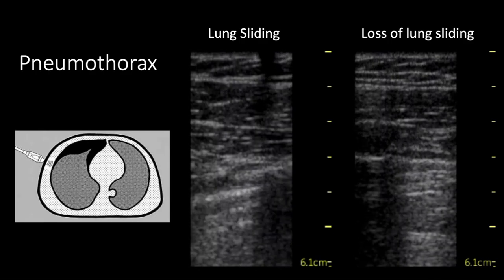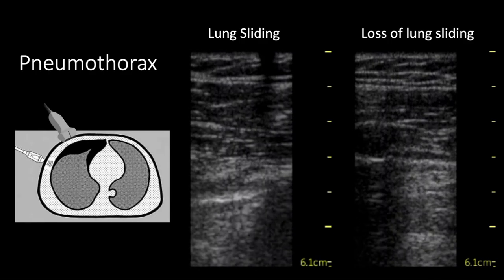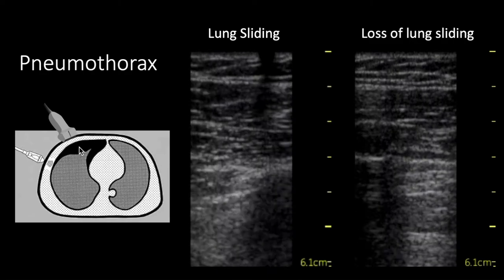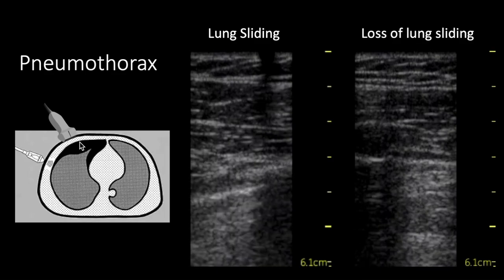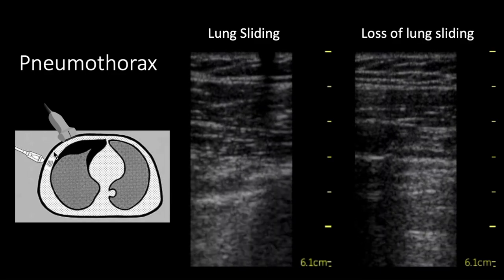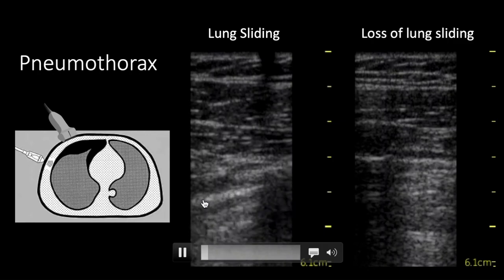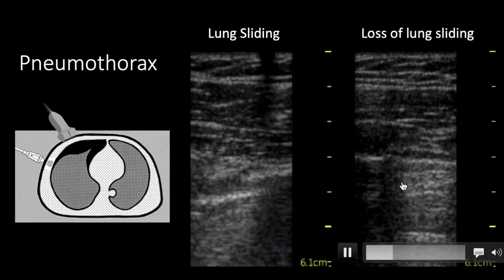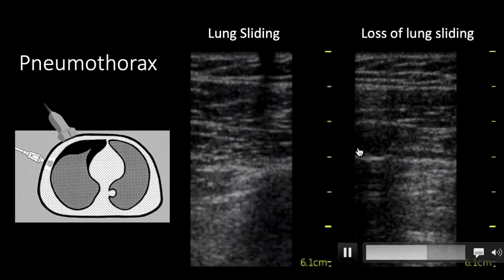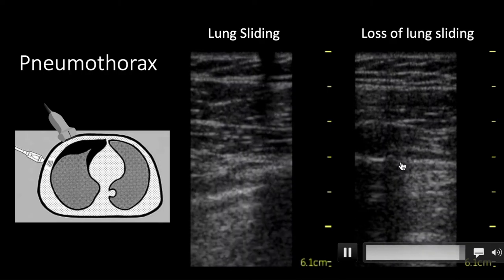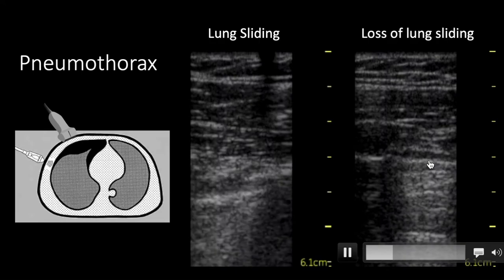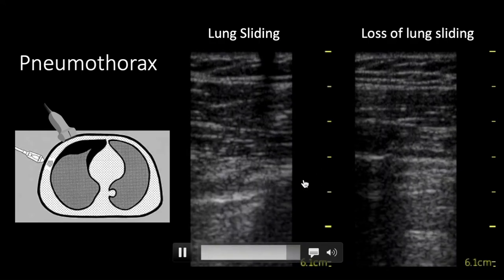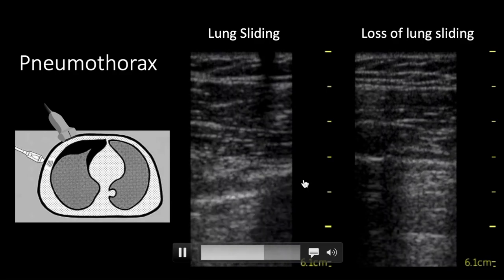Let's look at what pneumothorax appears like. If you put the probe on this patient, the lung has fallen away from the chest wall, so you'll no longer see the sliding of the visceral and parietal pleura. Here's a rib shadow and here's the pleural line. This is normal lung sliding or shimmering on one side. On the other, here's a rib, here must be the pleural line, and there's no movement because it's only a single pleura without visceral and parietal sliding against each other.